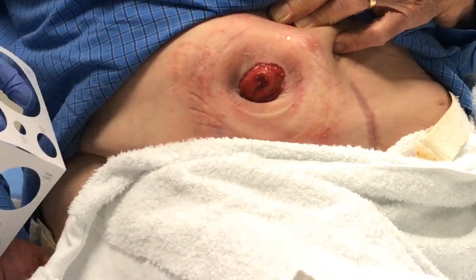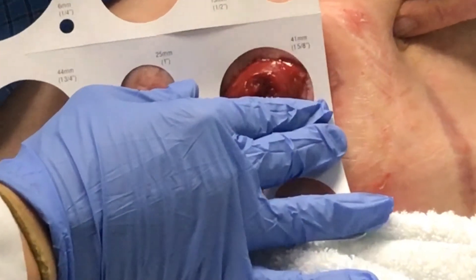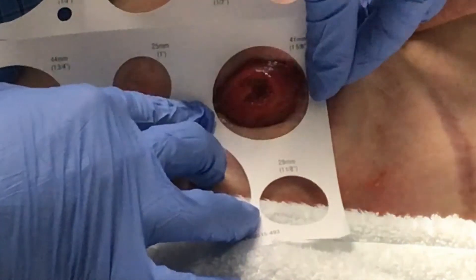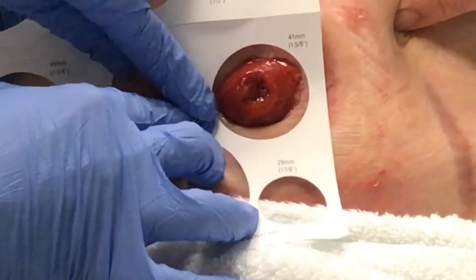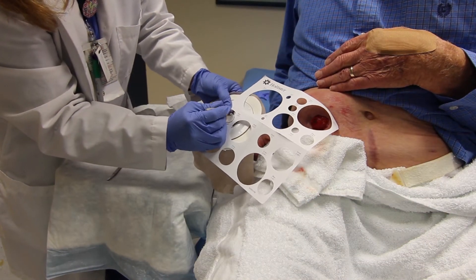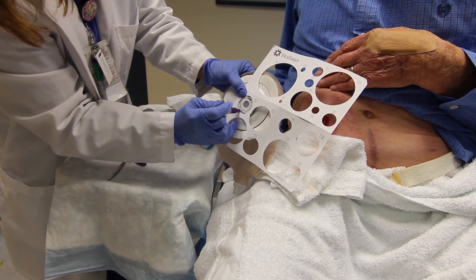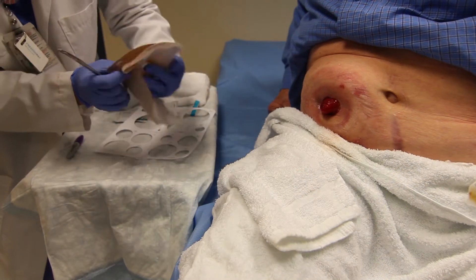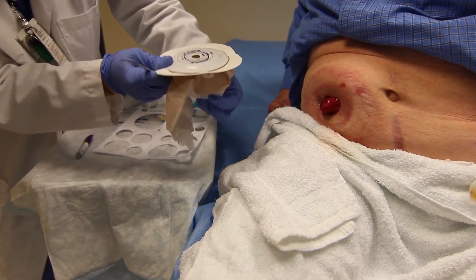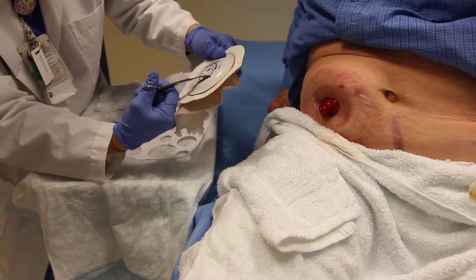Use the stoma measuring guide to measure the diameter of the stoma, getting as close to the stoma as possible without touching it. You will want approximately 1/8 inch of healthy skin around the stoma. Once you have your size, trace onto the back of the pouch with your marker. Cut this out to the trace line. If you are using a one-piece pouching system, pull the other side of the pouch away from the cutting surface to prevent cutting the pouch.